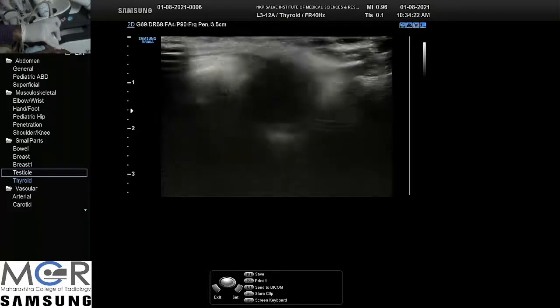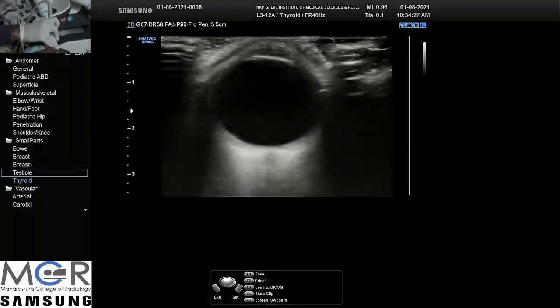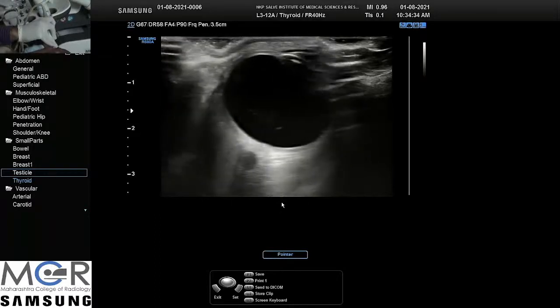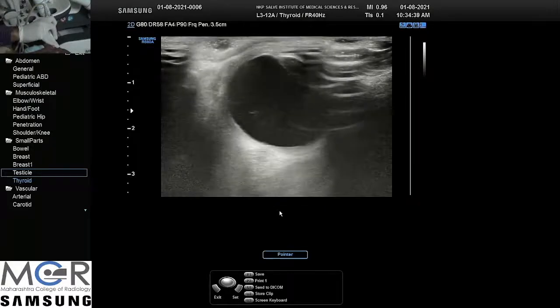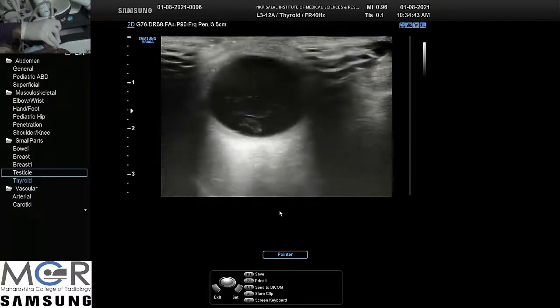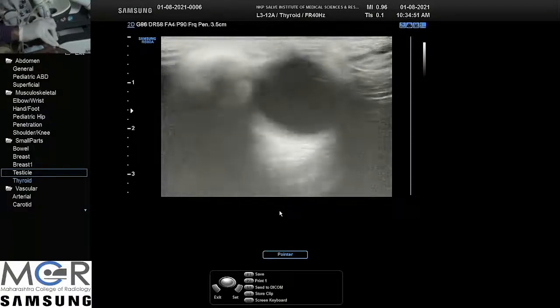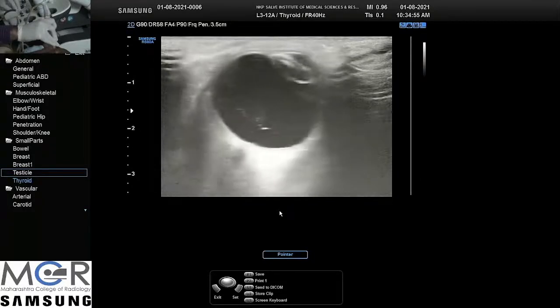So do not move the eye now. So you can see the optic nerve now. There is no detachment here. There are no membranes. Will increase the gain. Do not move the eye, stay like that. Patient compliance sometimes becomes a very essential part. You can see some internal echoes there. Due to high resolution probes, you can detect the slightest of opacity in the eyeball.